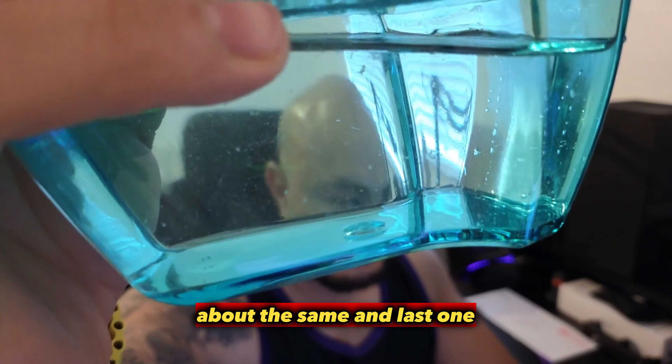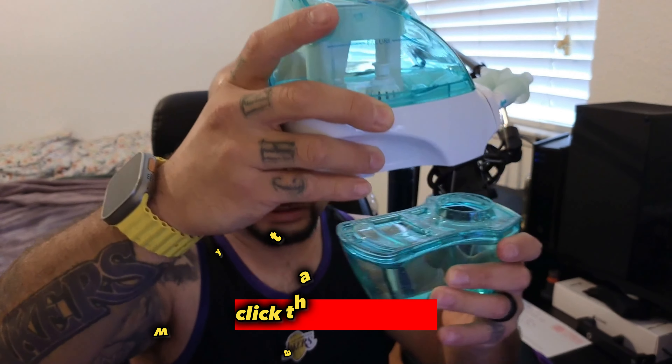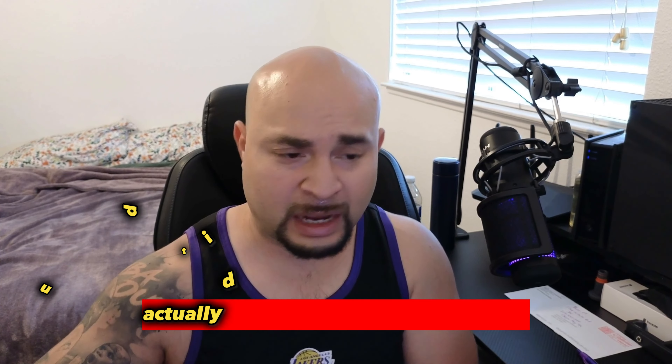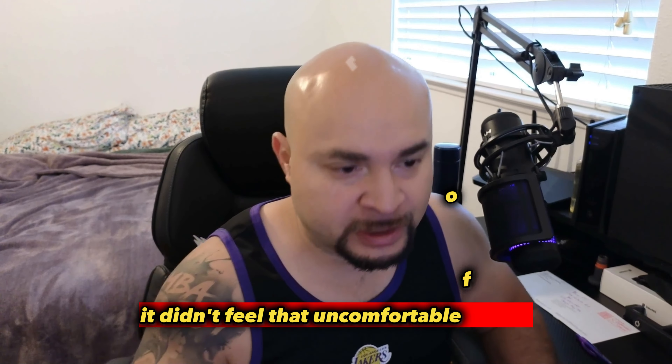About the same as the last one. Then to empty it out, click that way — boom. It has a little hole, so I just pour it in here. It's pretty simple. It actually didn't feel that uncomfortable to me.